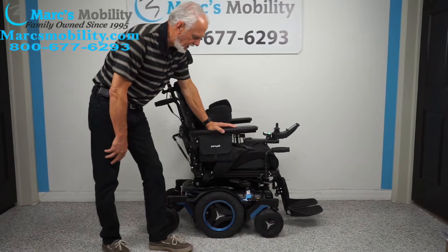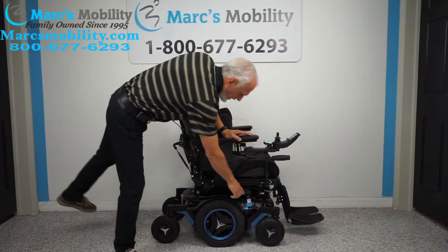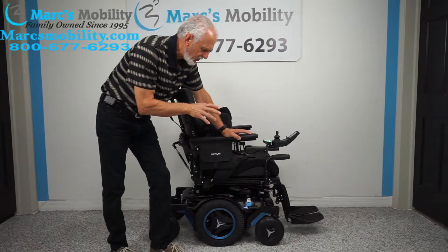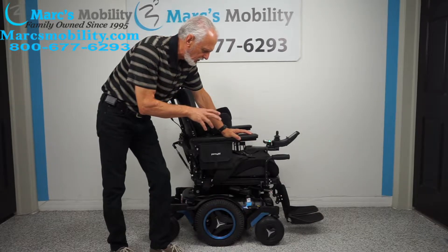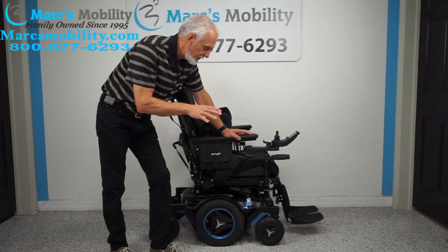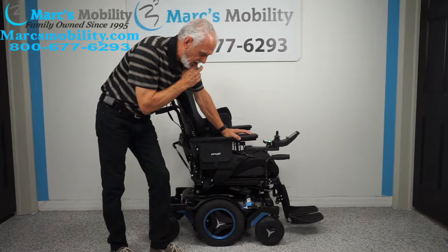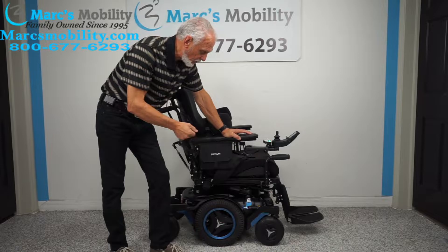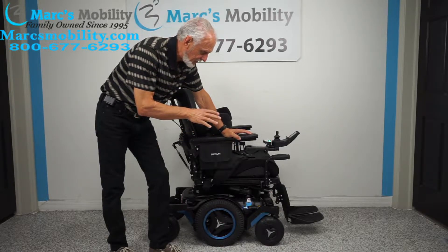Hi folks, we have here one of a kind — this is the Permobil M5. M5 means mid-wheel drive, and the five indicates the higher quality power chair. This Permobil is very hard to find; you hardly ever see them anywhere because it's very expensive, and there are just not any others to be found in this shape.